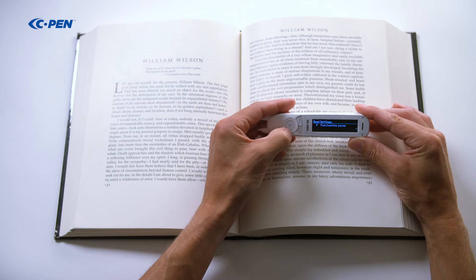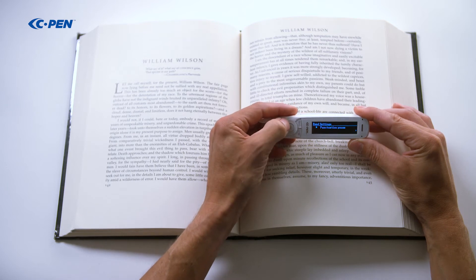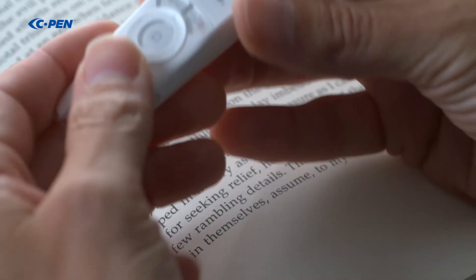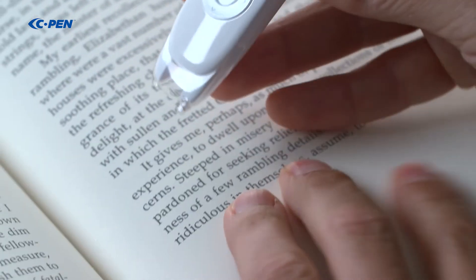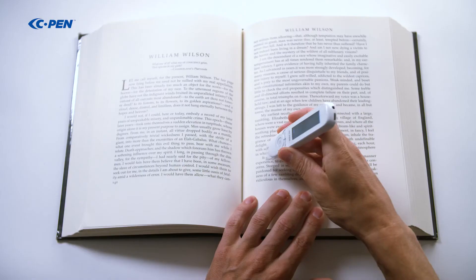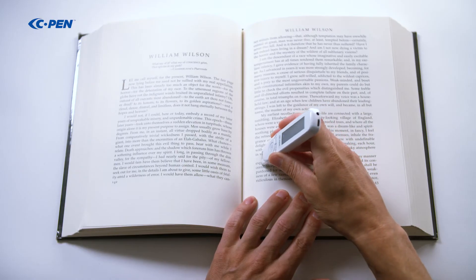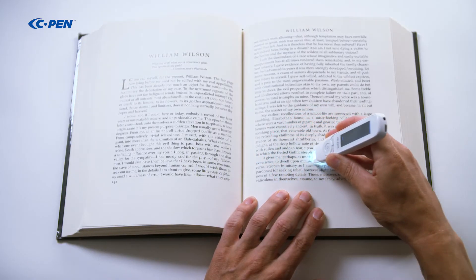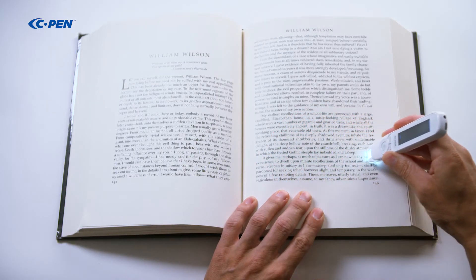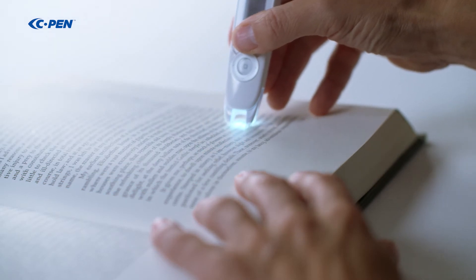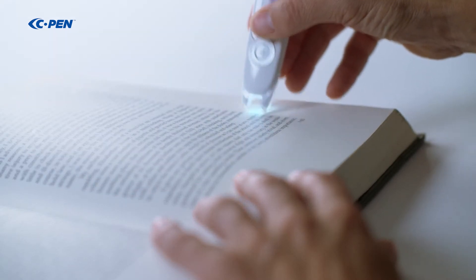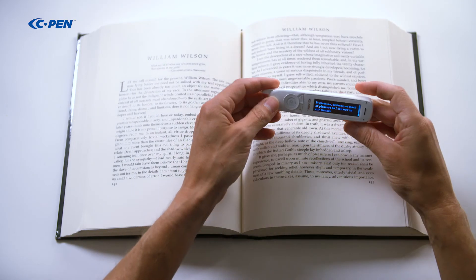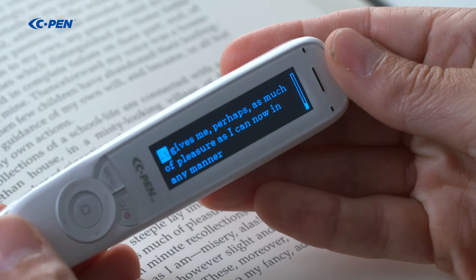The text will be read out immediately after a scan is finished, but will be interrupted if you keep scanning more lines. To make it easier to visually keep up with the reading, each word is being highlighted when read.